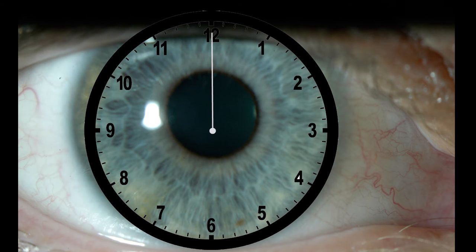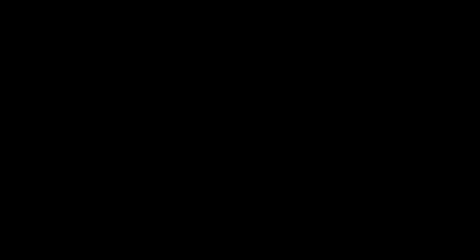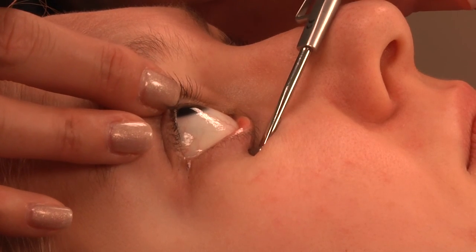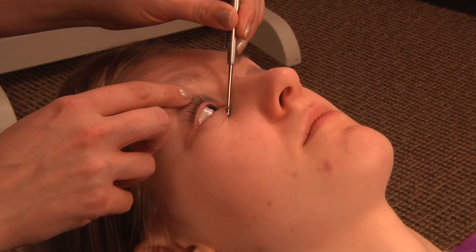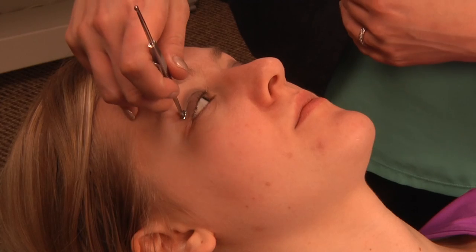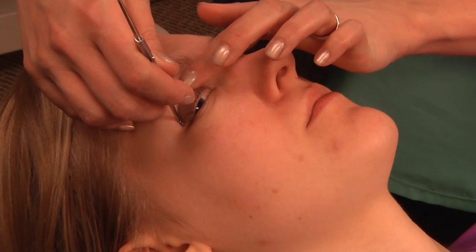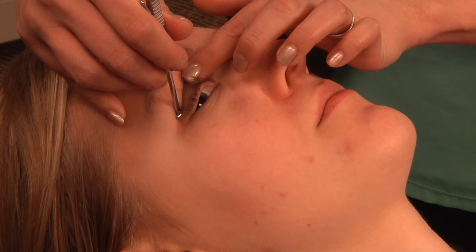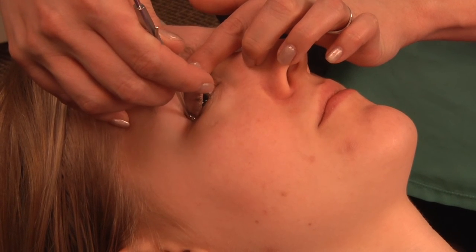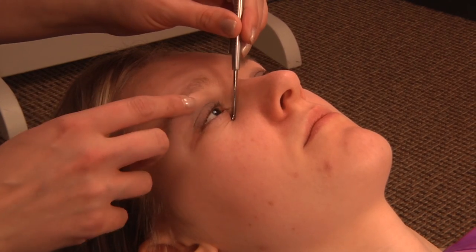Each indentation encompasses one and a half clock hours of the retinal view. You may need to move the indenter side to side or up and down to obtain a full dynamic view. To move to different clock hours, slide the indenter on flaccid eyelids, or lift and reposition with tighter lids. Check the patient every couple of minutes to ensure correct gaze position, as it is common for the eye to roll downward under pressure. Remind the patient to continue looking upward toward the forehead.